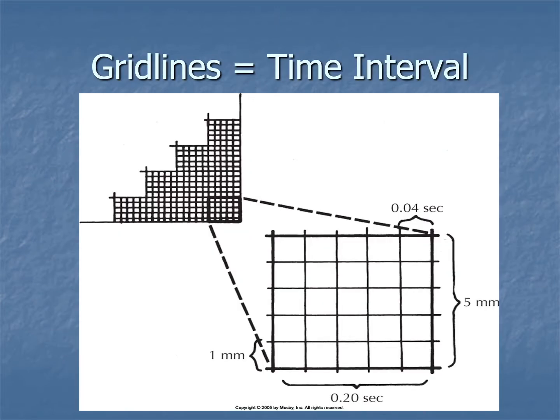There's a lot of ways to actually calculate, if you will, the actual rate. So with modern technology the way it is, the rate is pretty much spelled out on the monitor.